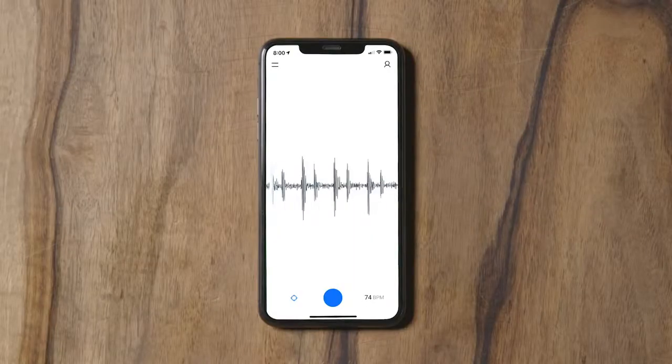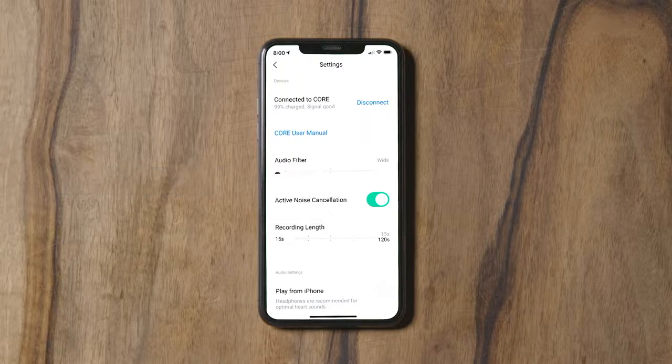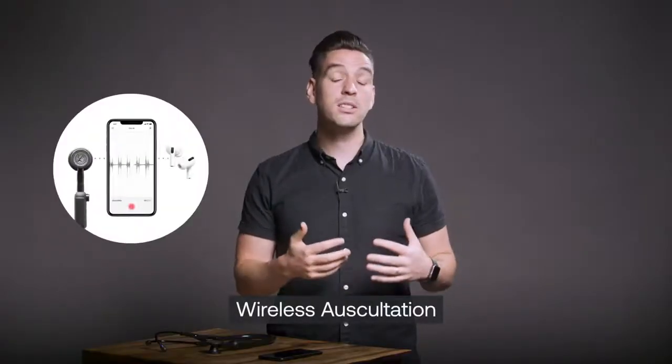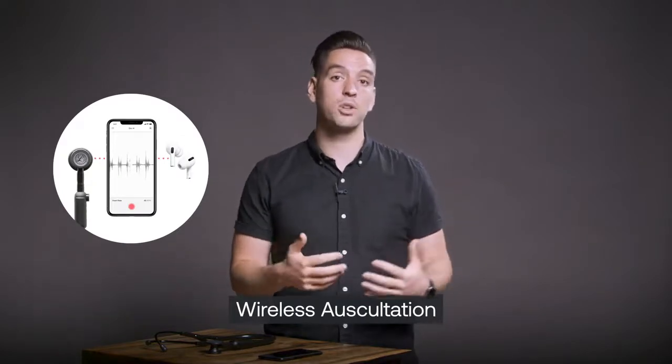To review and adjust your settings, open the menu on the upper left side of the screen. Here you can view the battery percentage for your Lippmann Core, change the audio filters and adjust recording length. You can also turn on active noise cancellation and toggle on the play from phone option to use the wireless auscultation feature, which allows you to listen to auscultation sounds from your preferred headphones rather than the stethoscope itself.